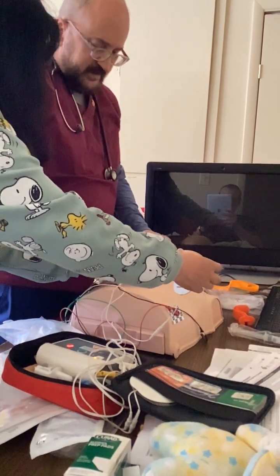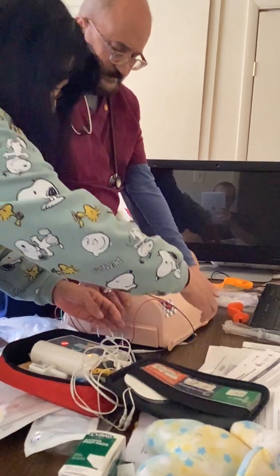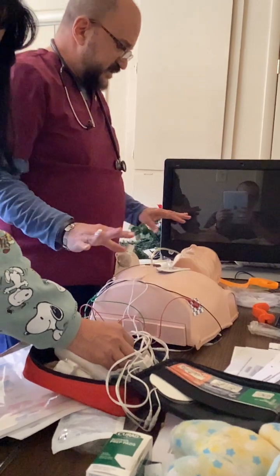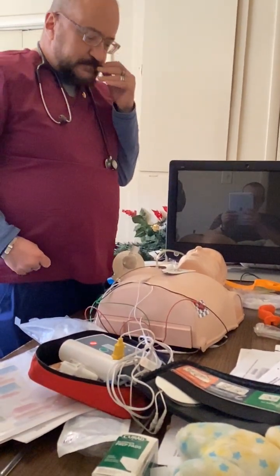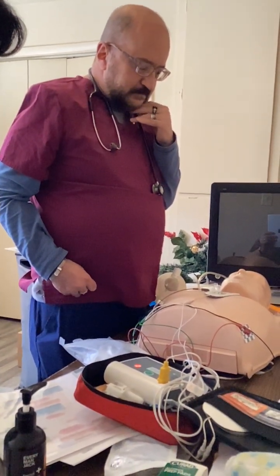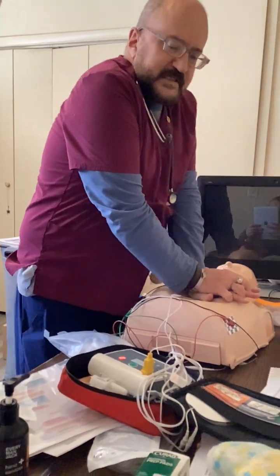Apply pads to the patient's bare chest, one on the front, one on the back. Plug in pads connector next to flashing light. So it's looking for VFib. Don't touch the patient. Analyzing heart rhythm. Stay clear of the patient. Do not touch the patient. Shock advised. So I'm going to start CPR because it found VFib.